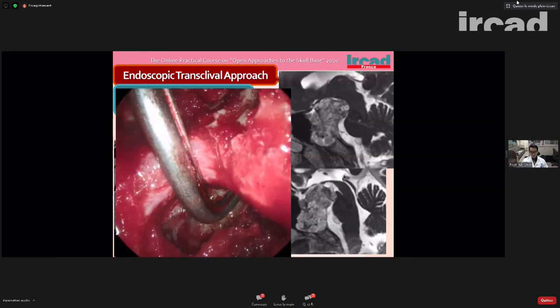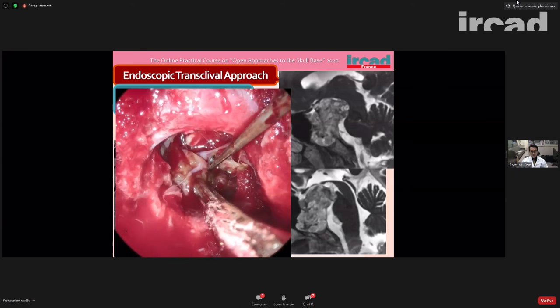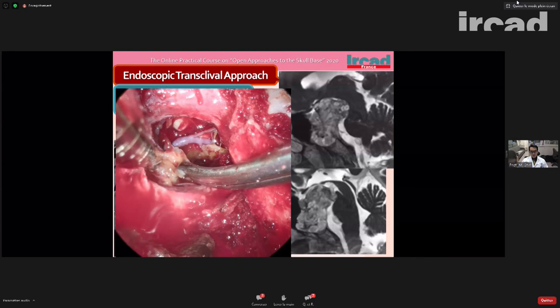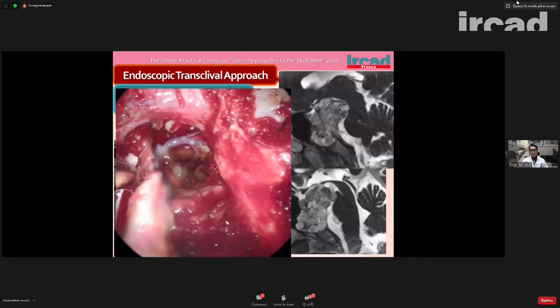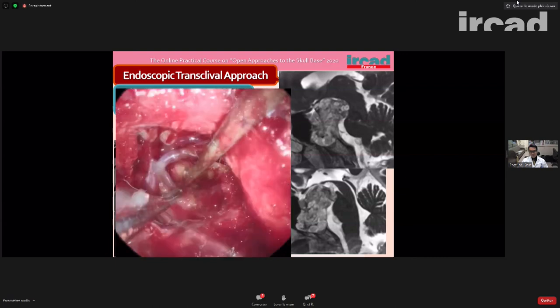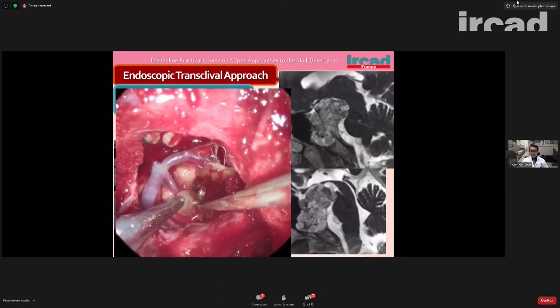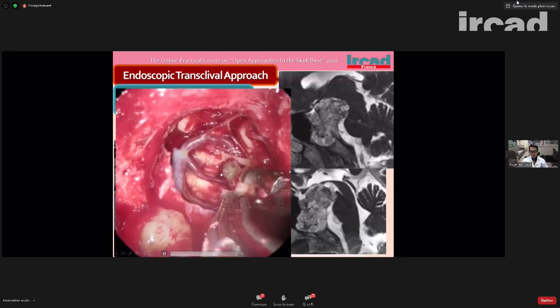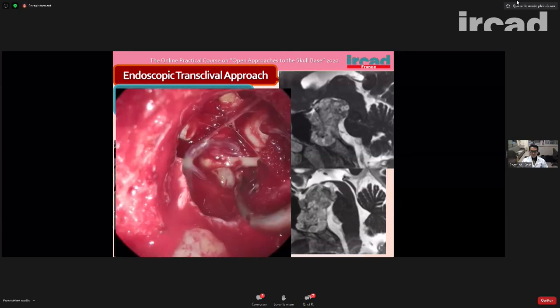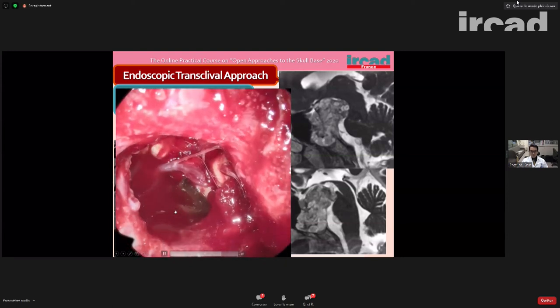We start dissection from the brainstem. And in this case, the tumor capsule was easily dissectable from the brainstem. And in chordoma cases, the tumor is often dissectable from the arterial component. So we dissect the tumor from the basilar artery. The chordoma is often attached to the pia mater or arachnoid, but it usually does not invade into the vascular wall. So we remove the tumor from the superior cerebellar artery.